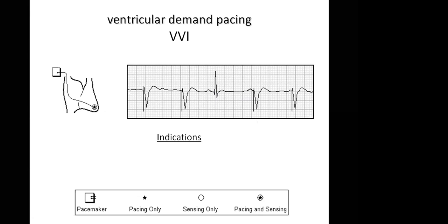So justify the mode then. So the ventricle is paced. And so we can find that. Then, let's see. Ventricle is sensed as well. Please just give me a few minutes.